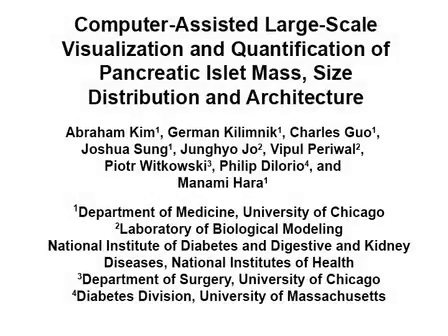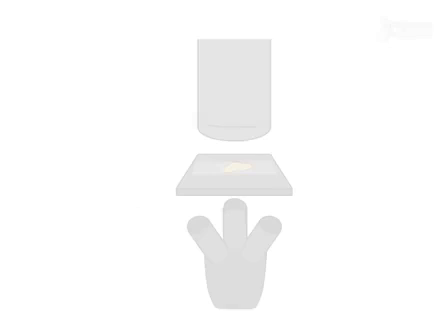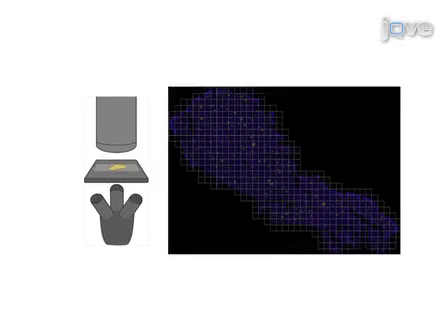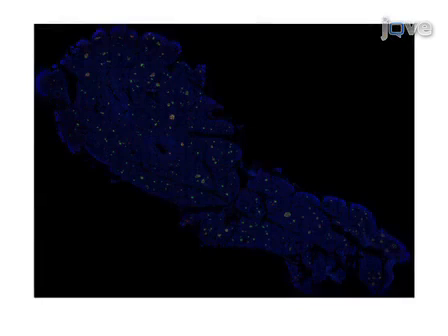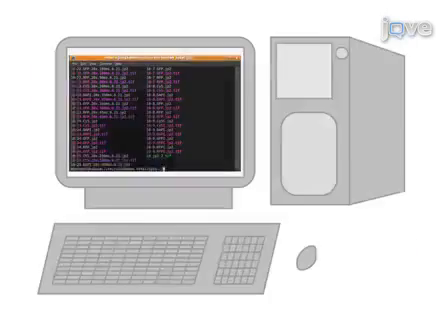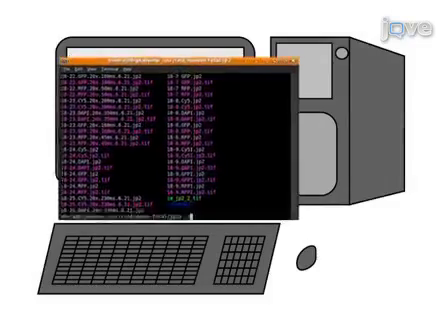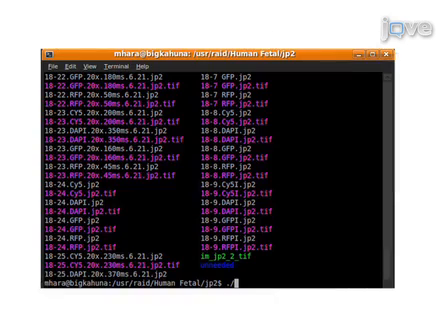The overall goal of this procedure is to collect unbiased representative data within a limited sample and to precisely analyze the complex three-dimensional structure of the tissue. This is accomplished by first capturing virtual slices of immunohistochemically stained pancreatic sections. Then, the virtual slices are quantified with the IHC virtual slice macro in ImageJ software, and the data is analyzed with scripts written for Mathematica.